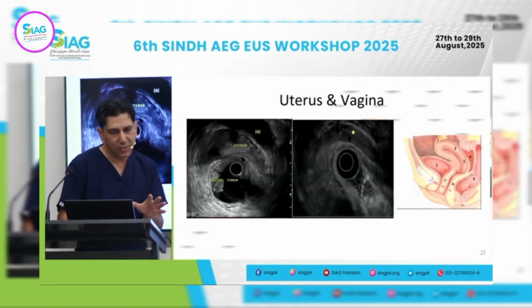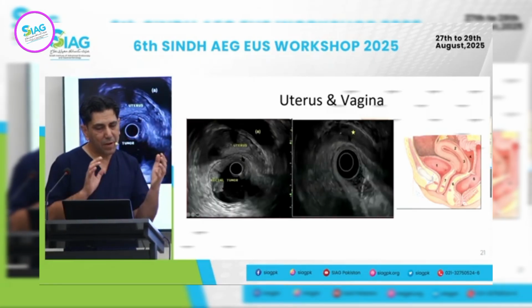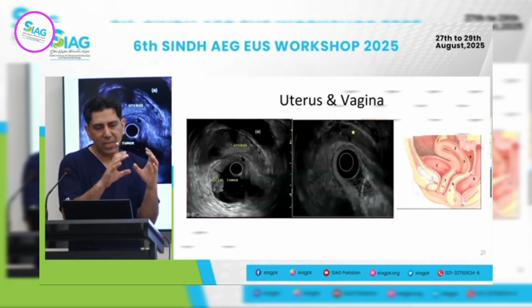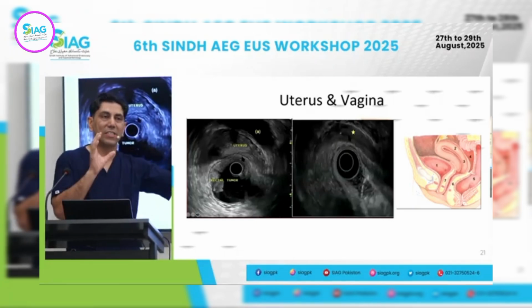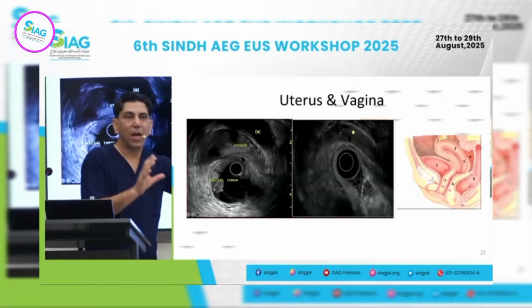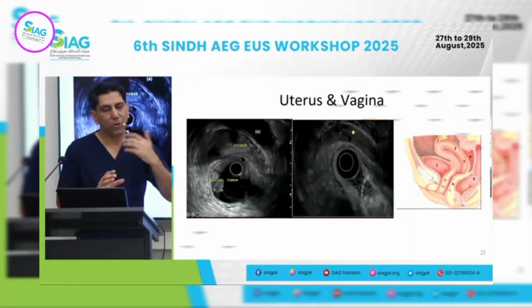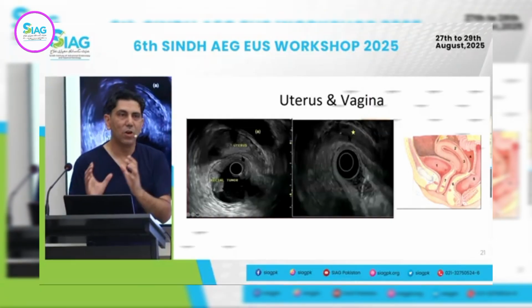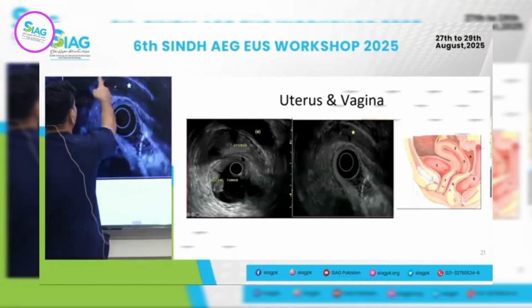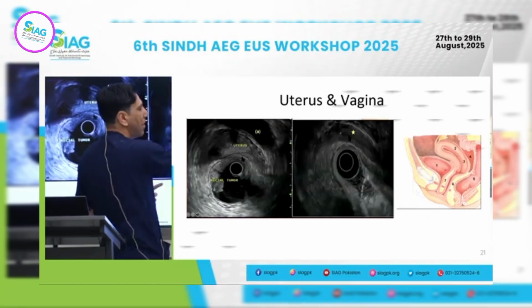Now, difference in the female patient, because the prostate is more like a bean-shaped structure, whereas the uterus that you're going to see depends on what cycle the patient is in. Is it a young patient? Is it an old patient? Have they had a hysterectomy or not? It may give that elliptical shadow, but it then tends to balloon away from us. So it tends to just completely merge, and you can't actually identify the boundary.